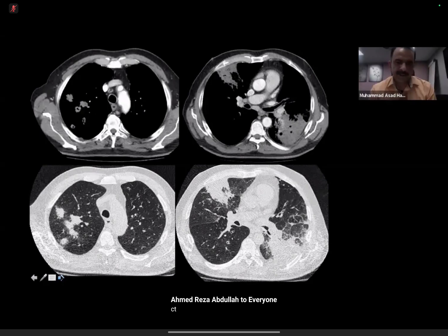Good. Normally, these are the basically large consolidation areas. Malignancy, alveolar cell carcinoma, they can be sheet-like and they can appear to be bilateral on their presentation. Okay. Now, CT is the usual modality of choice because we have very small areas when we are targeting it. But in this case, or the other cases which you may see in your practice, if there is a large tumour, large lesion, especially the subpleural ones, you can also do all those biopsies under ultrasound guidance as well.